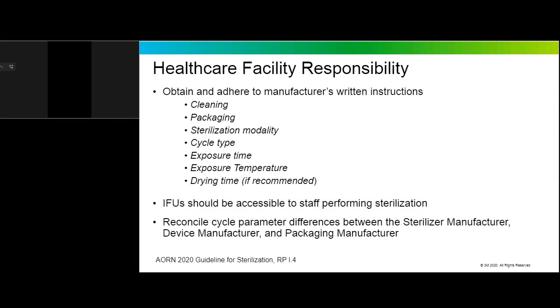When a manufacturer makes a new device, it is their responsibility, and it's actually part of their package that goes into the FDA to get clearance to sell that product. They have to show the FDA that they understand for reusable devices that it can be cleaned and that they have validated a method of sterilization. So that's the responsibility of the device manufacturer. You, working at a healthcare facility, have the responsibility to make sure you have those written instructions from the manufacturer.